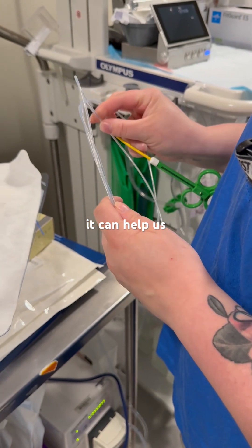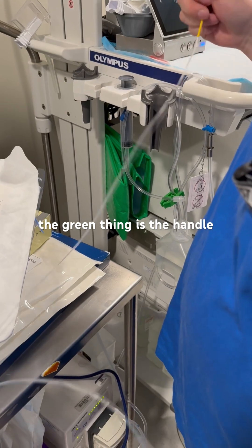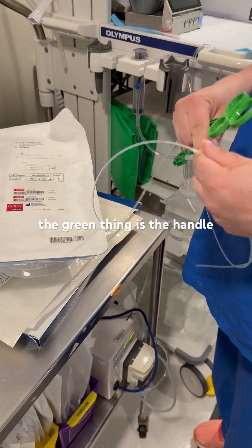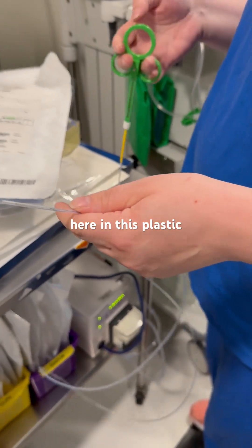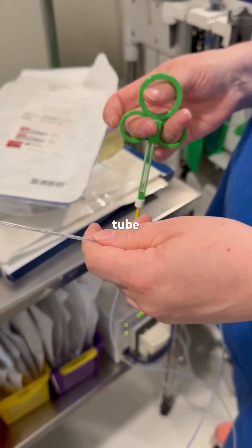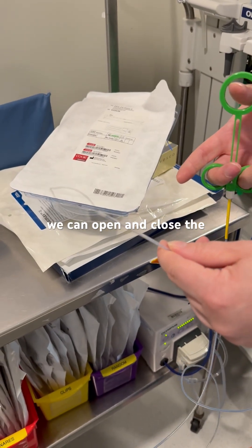This device can help us in our procedures from day to day. The green thing is the handle, and there is a metal mesh or wire here in this plastic tube. Using the handle we can open and close the snare.